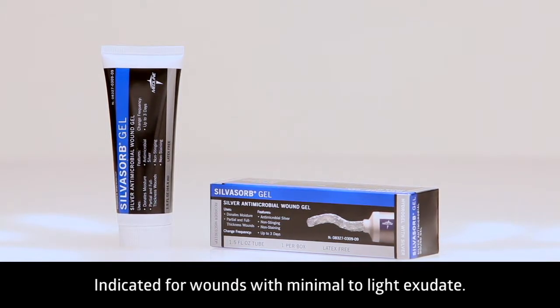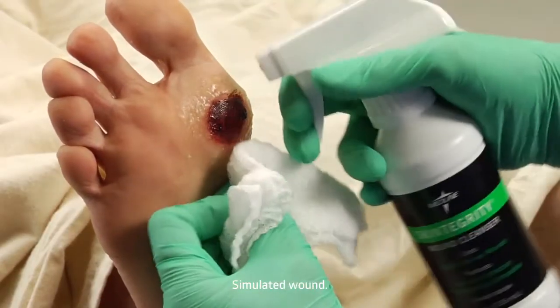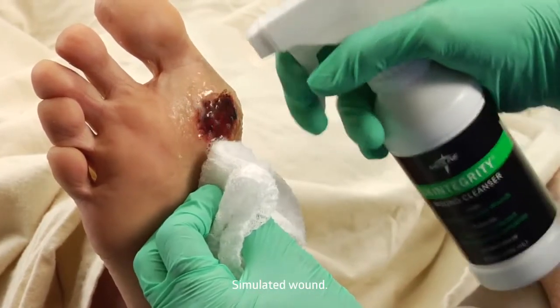Silvasorb Gel is for wounds with minimal to light exudate. Begin by donning gloves and cleansing the wound environment.